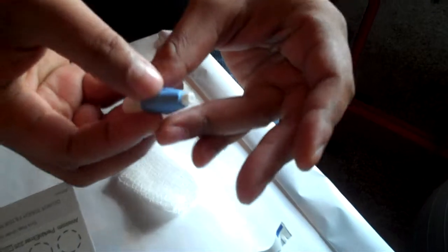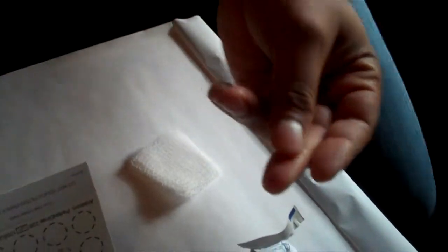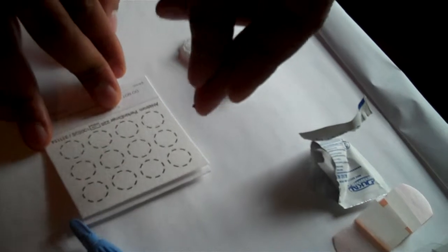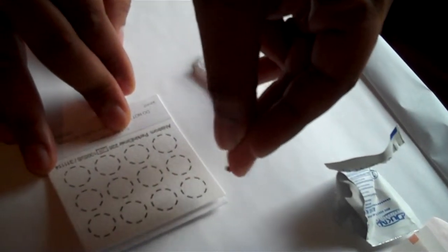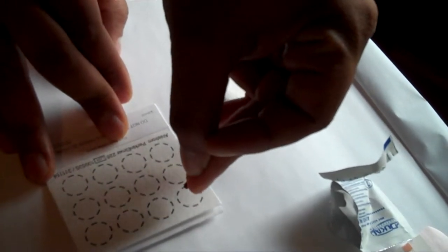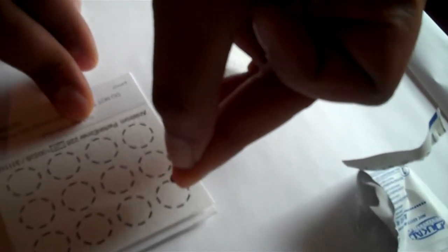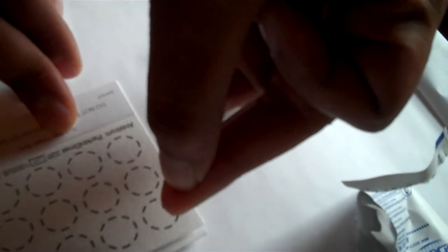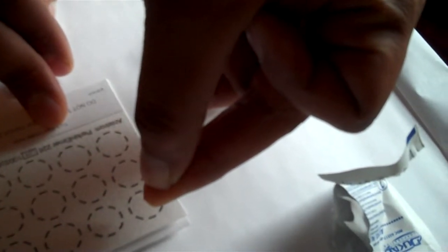Use your alcohol swab to clean your finger first. Here's the thing about the blood spot test — put the lancet on your finger, give it a good poke, then give it a little press. What's important is you want to let your hand hang down, getting above the blood collection paper so you can see the blood drip down. Just milk your finger, trying to get it right in the middle of the circle. Believe me, it doesn't take that long and it doesn't hurt — it doesn't hurt to poke your finger.